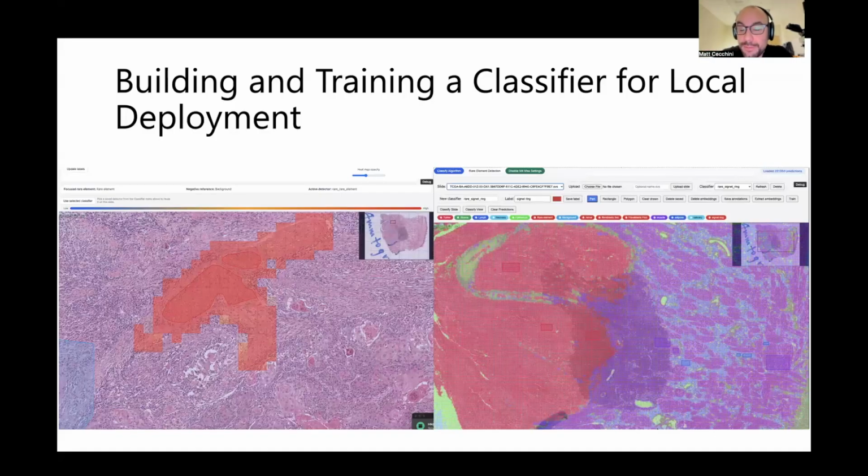Imagine you're hunting for perineural invasion and you can just click a few buttons and then all the nerves actually show up on the slide. And then you can better identify the area that has perineural invasion. This can be really powerful. And you can just build this and run this on the fly. In fact, here I actually classified all the different cellular components, with red for tumor and some of the muscle and things on the slide. So there are lots of ways that you can build it, and these things have a fair bit of power in what they can do.